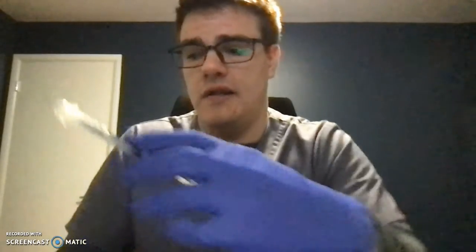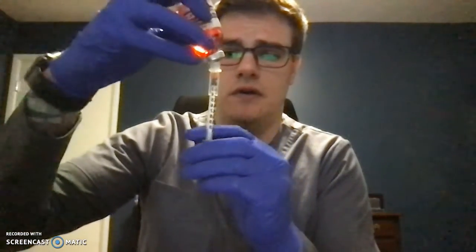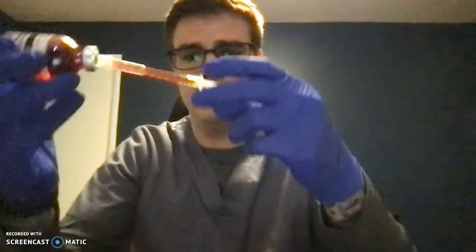All right. And now we're going to fill the syringe with the medication. That's the next step, right? Yeah, remove the cap, wipe it up, yes. So in this case, we're going to want to fill it with the same amount of air. So since we're filling with 1 milliliter, we're going to pull this back to here. And then we're going to go ahead and fill that with 1 milliliter of air in the vial. And then we're going to go ahead and draw back our medication. So again, we're going to go ahead and draw 1 milliliter out in this case. Okay.